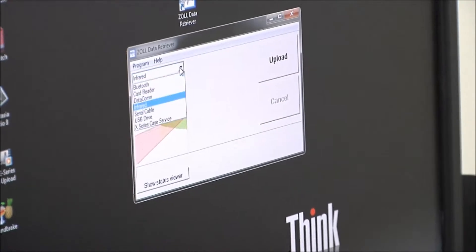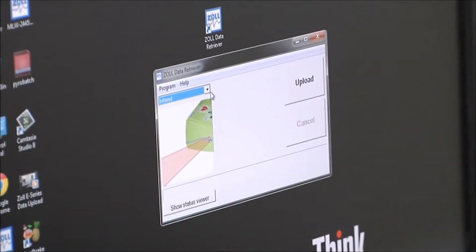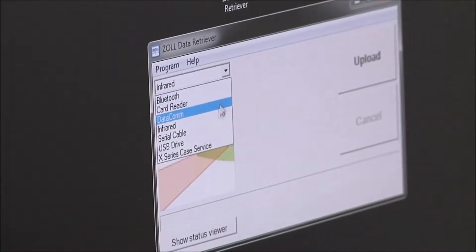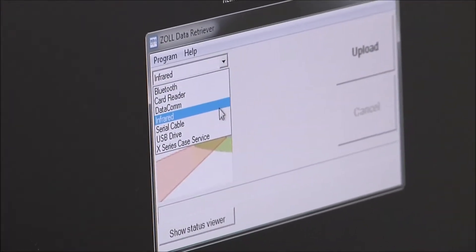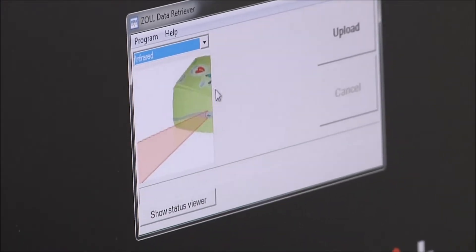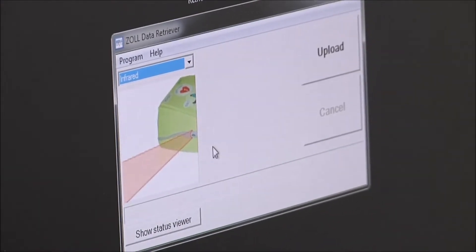And then I'm going to make sure that infrared is selected in this little drop-down menu of communication devices. If you don't have infrared selected, you're not going to be successful.